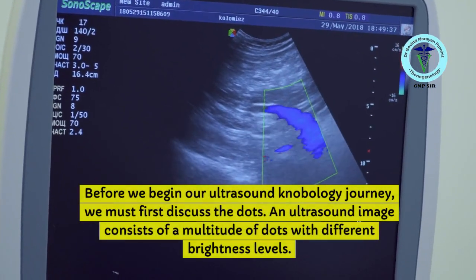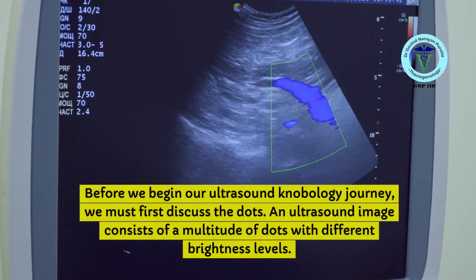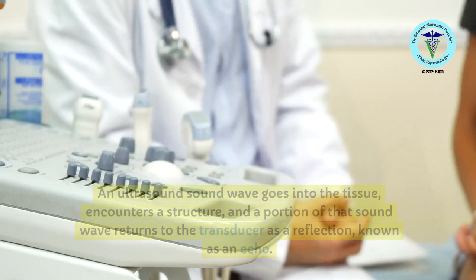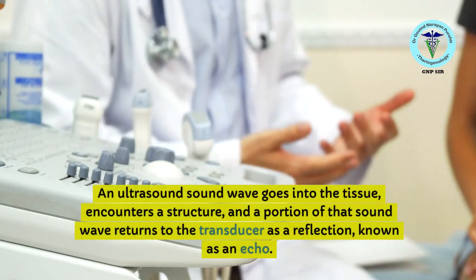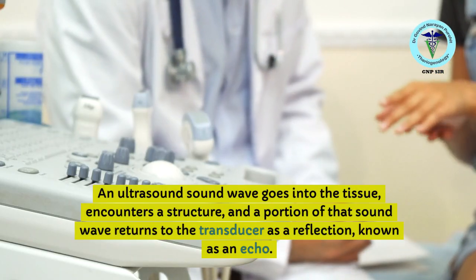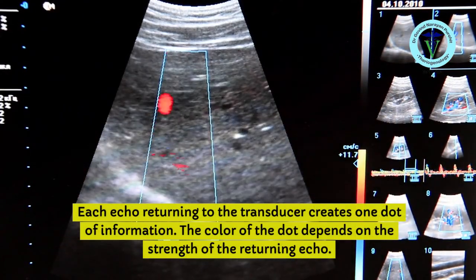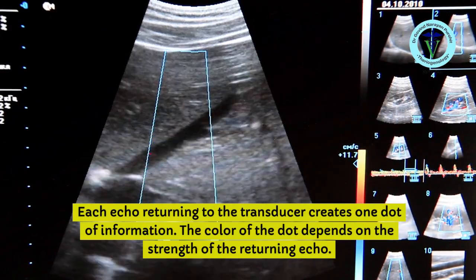Before we begin our ultrasound knobology journey, we must first discuss the dots. An ultrasound image consists of a multitude of dots with different brightness levels. An ultrasound sound wave goes into the tissue, encounters a structure, and a portion of that sound wave returns to the transducer as a reflection, known as an echo. Each echo returning to the transducer creates one dot of information. The color of the dot depends on the strength of the returning echo.